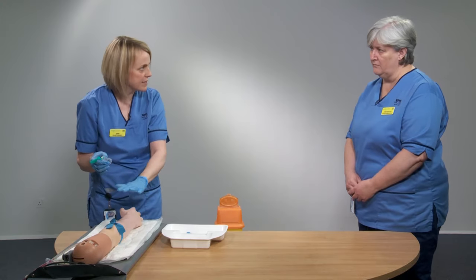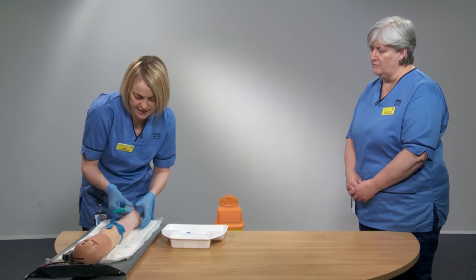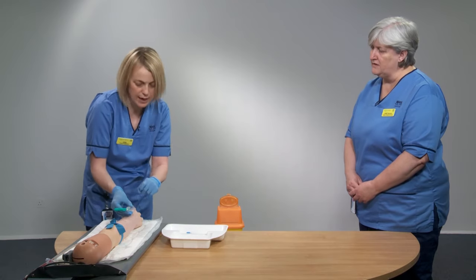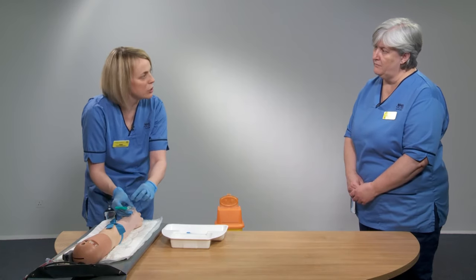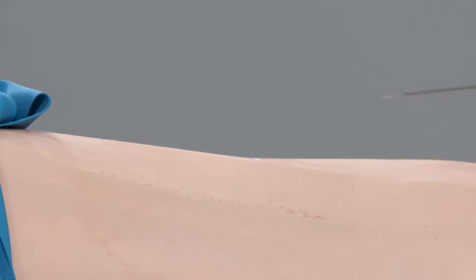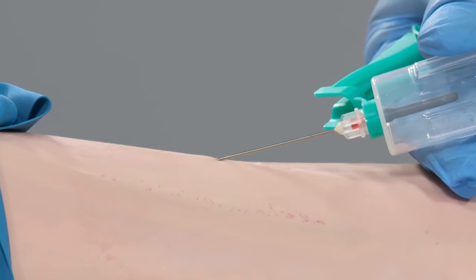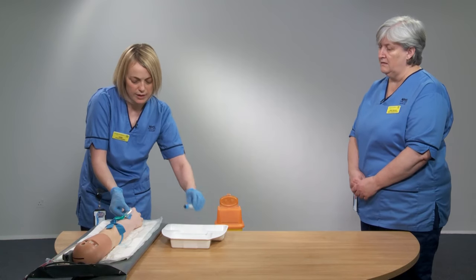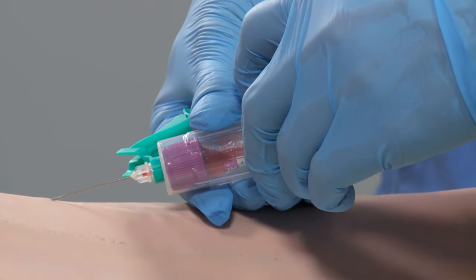As with the butterfly, avoid contaminating the skin, use your dominant hand, and hold the device so your hand is well away from the needle while still being able to see the flashback chamber. The flashback is less obvious on the quick shield, so look closely at the small chamber just behind the needle. Enter at a 30-degree angle and watch carefully for flashback to confirm you're in the vessel.